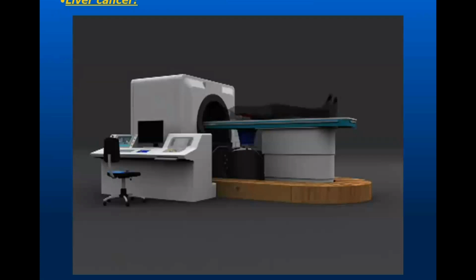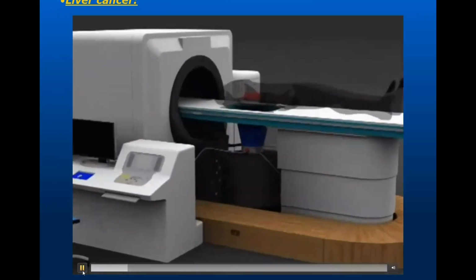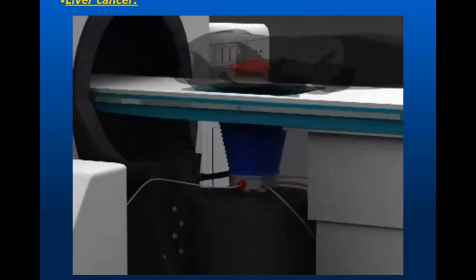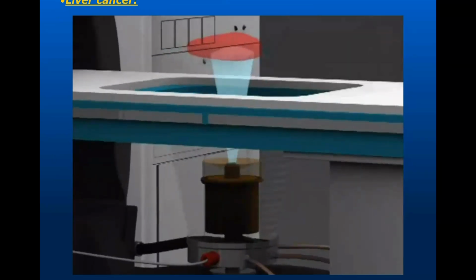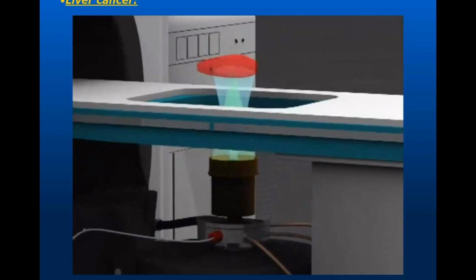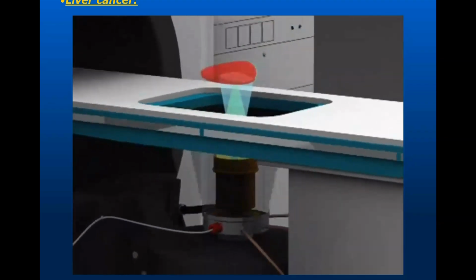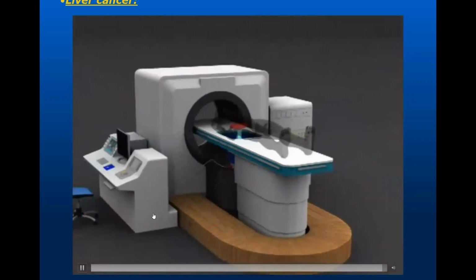Let's keep this interesting. So I will show you now a case of treatment of a liver tumor. Just want to make sure you understand. So we put the patient on the table and we actually do the following. So we start imaging using our imaging transducer here. We are basically scanning the liver to see where is our target. Once we see it, we will turn on the treatment generator or the transducer. So the green is the HIFU and the blue is the diagnostic ultrasound. This is how the treatment goes.